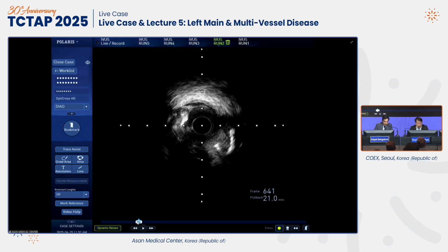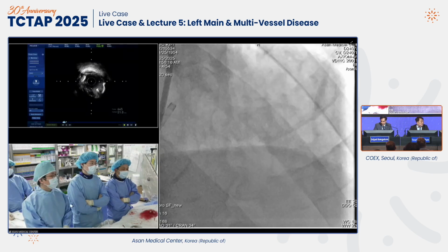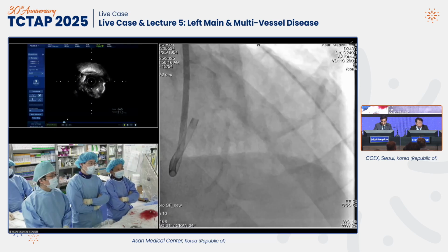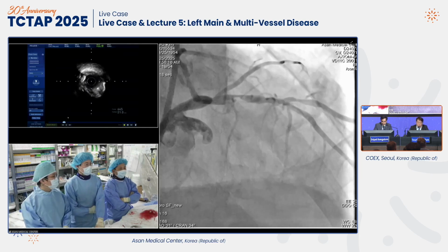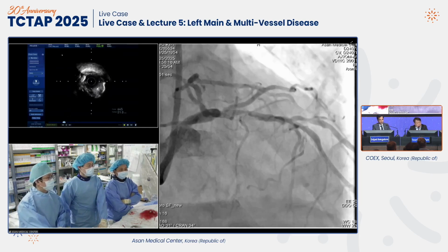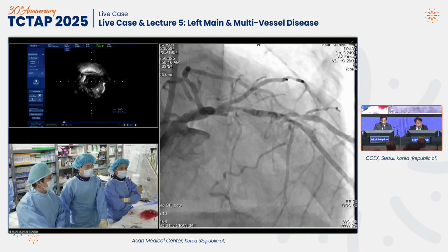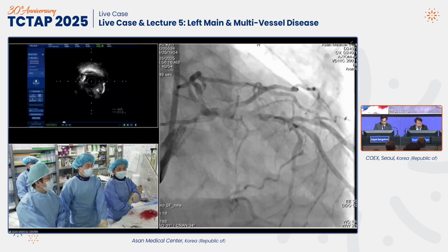So I think you're dealing with a couple of bifurcations. Yeah, that's right. It's a very complex situation: I have the diagonal bifurcation disease and the left main bifurcation disease. Right. So how would you do that? We have limited time, Dr. Kang. What would you do?